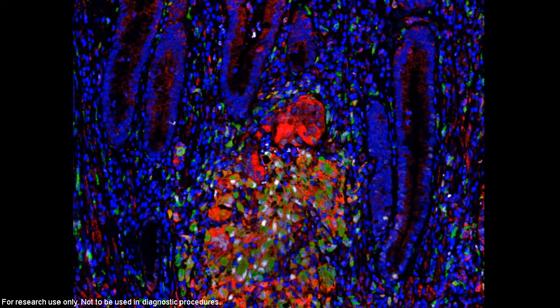And we can see that the nuclei of many of these phagocytes that are positive for our target of interest are also positive for phospho-STAT1, suggesting that these cells are perhaps, in fact, responding to a burst of interferon gamma associated with that loss of crypt integrity, and they're activated in some way. And so in this one image, we've been able to capture a wealth of information to inform our in vitro scientists on how to develop disease-relevant assays to probe our target of interest.